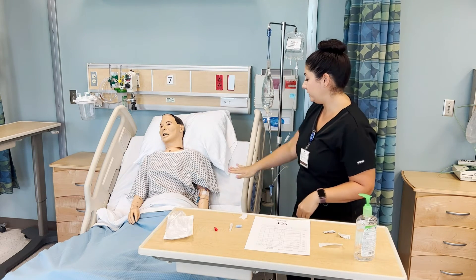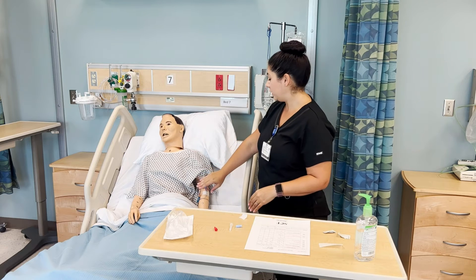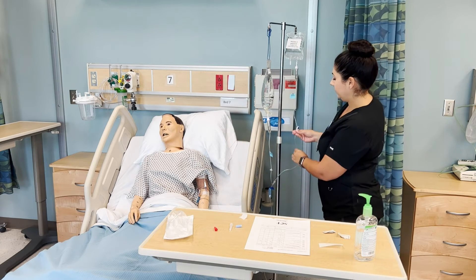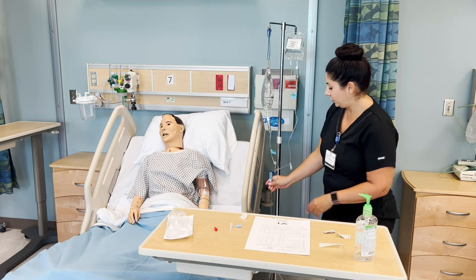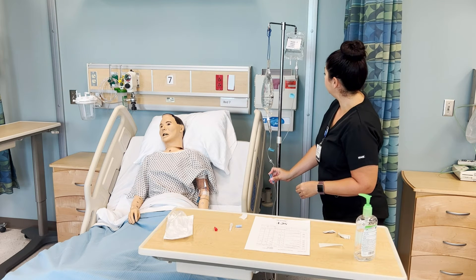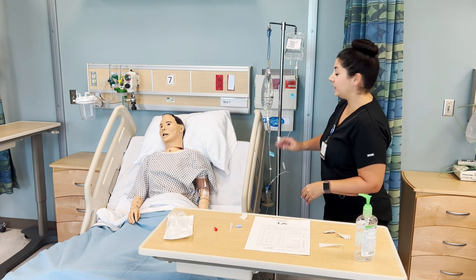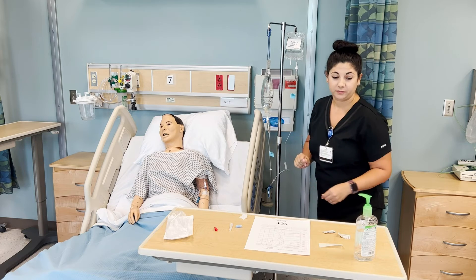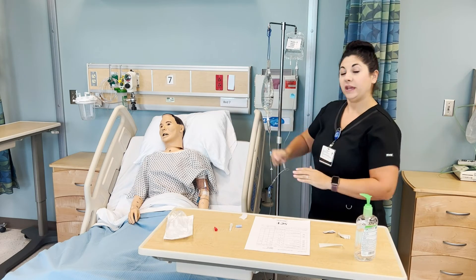Before I run my medication, I want to assess my patient's IV site, making sure they're not having any pain there and there's no sign of phlebitis or infiltration — no redness, no warmth. Everything looks good. Once I have that, I will open this completely and use the primary roller clamp to set my drip rate, which was 28 drops per minute — so seven drops in 15 seconds. I'm double-checking to make sure my drips are coming from this bag and not my primary bag. I will then wash my hands and document that the medication was started, then assess my patient and see if they need anything.